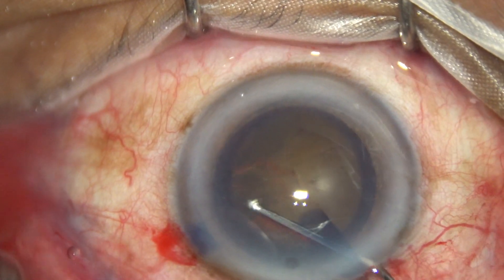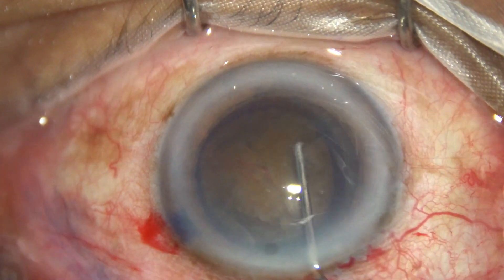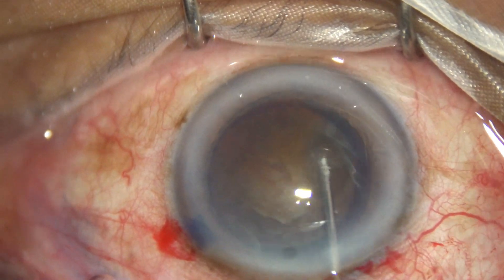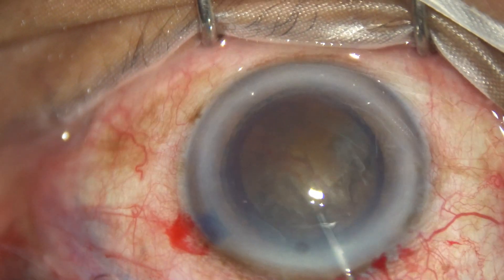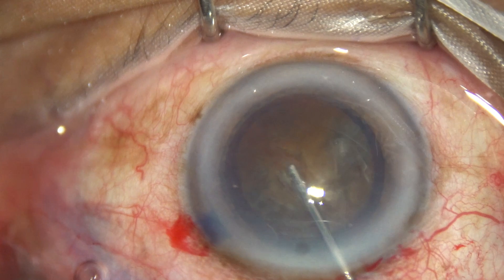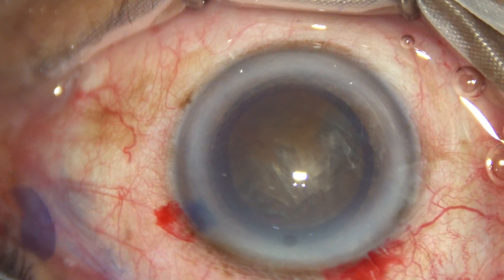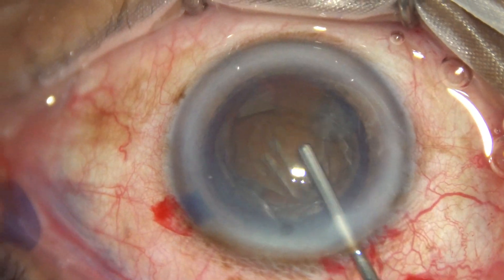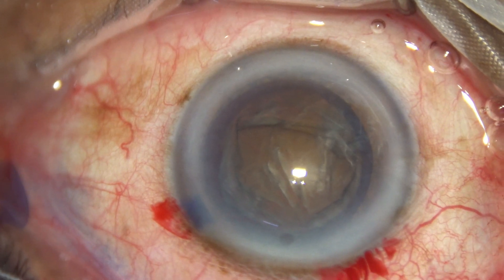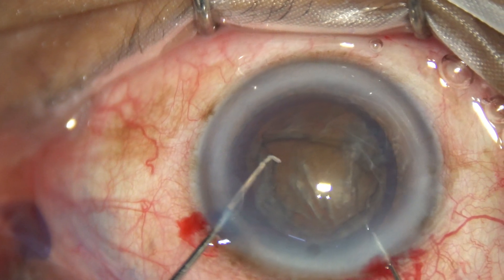Hydrodissection is performed using a 27-gauge cannula attached to a 2 cc syringe filled with BSS. Hydrodissection is done at multiple points by injecting small amounts of BSS. The anterior chamber is now filled up.